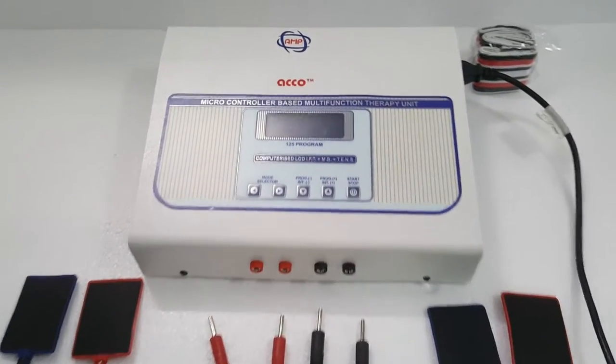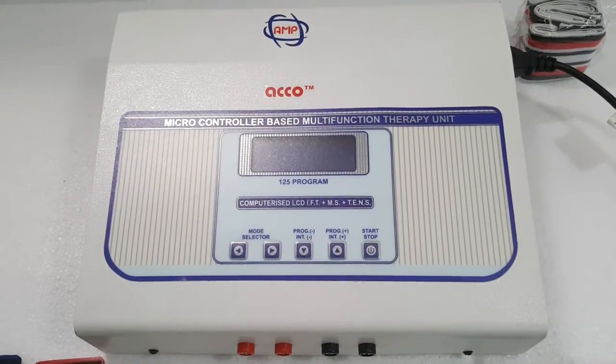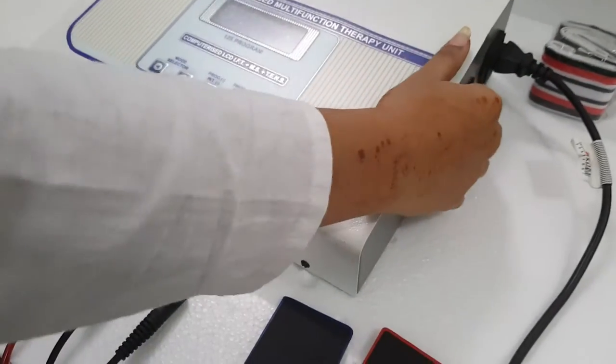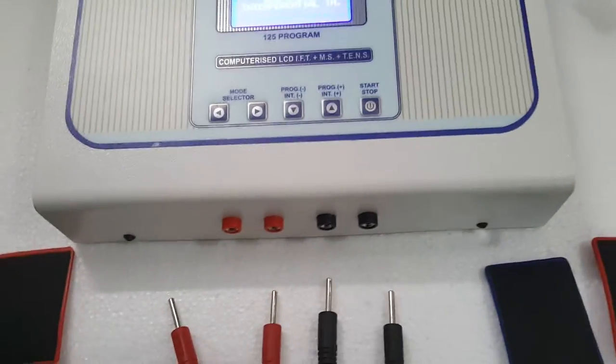Now we will show you the demo of acco Computerized IFT with MS plus TENS LCD 125 program Switch on the machine. Attach wire and pads.